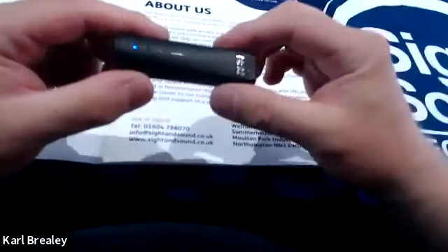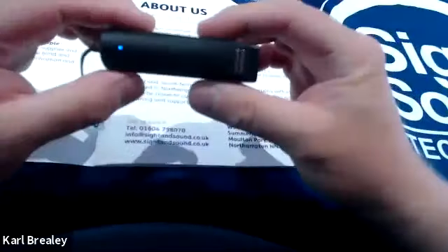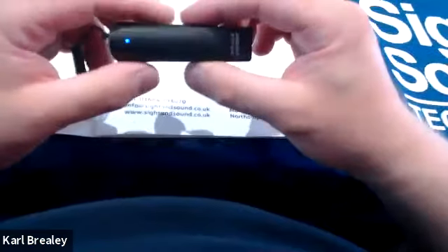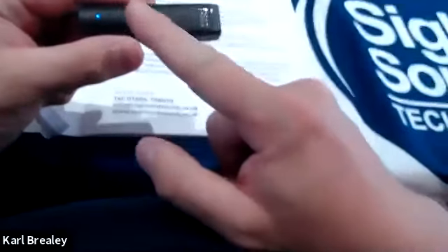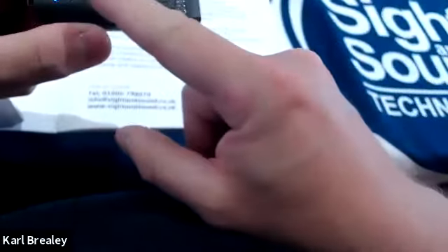Right, so if we move on to the other side of the OrCam now, so now we're actually onto the external, outer-facing side when it's clipped onto the glasses. Now on this side, there's a little blue LED that will stay on while the device is active. When it's starting up, there's a little light that flashes just below that, which will flash green or red. Now, just down from there on the device, there's what they call a touch bar, a sensor bar. This is about 1.5 inches long and gives you the ability to slide your finger up and down, touch, or anything. So what I'll do is I'll just slide my finger quickly from back to front just to give you a rough idea. Volume max.